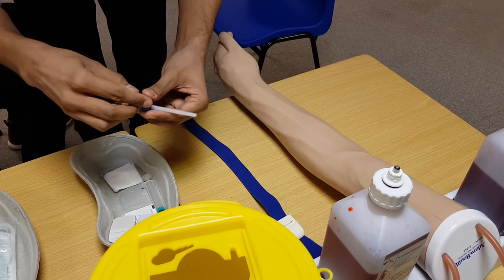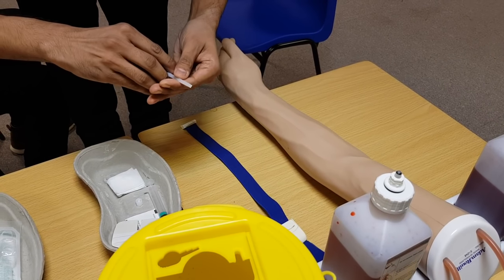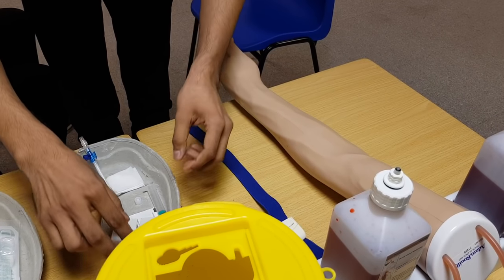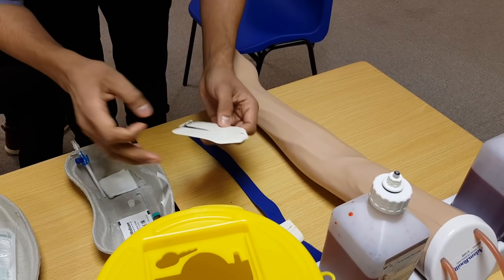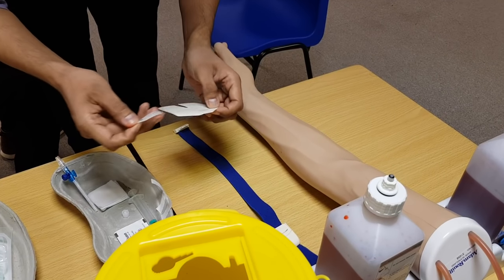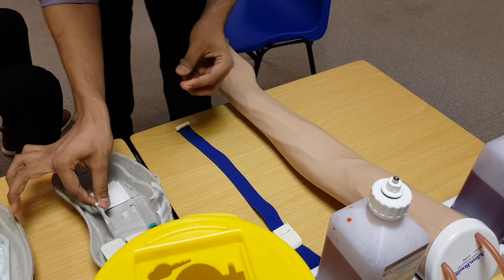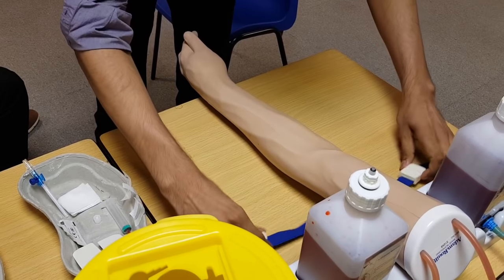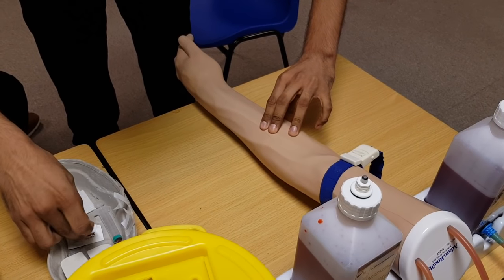Arrange the cannula by opening the white cap. Put it here, open the wings, and you can loosen this cap as well — but make sure you are not touching the outflow at any time. Keep it here. Arrange your Tegaderm as well. Take out the wings and paste it here. Take out the sticker and prepare the alcohol swab. Touch the patient and palpate the vein, then apply the tourniquet, palpate the vein again, then clean the site.